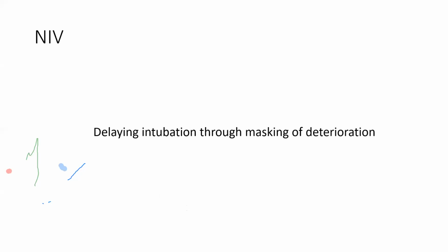This is the most harmful product of non-invasive mechanical ventilation. Applying non-invasive mechanical ventilation to a patient will almost always make him look better. So if you are not keeping a very careful eye on the patient, you may miss the opportunity to intubate him when he needed it, and delaying intubation is well known to cause adverse events on the patient's outcome.